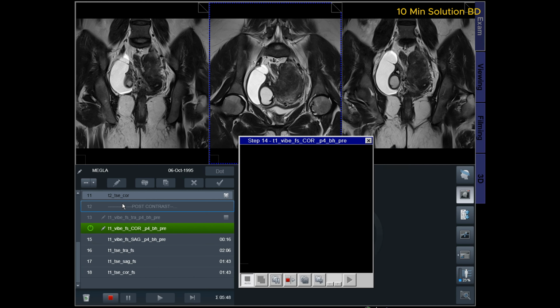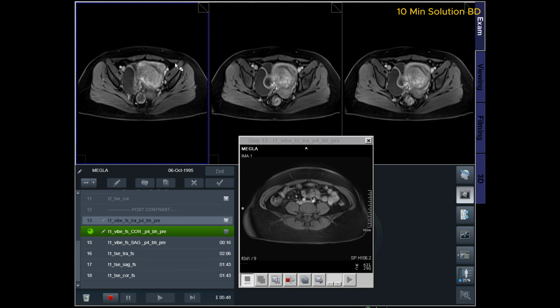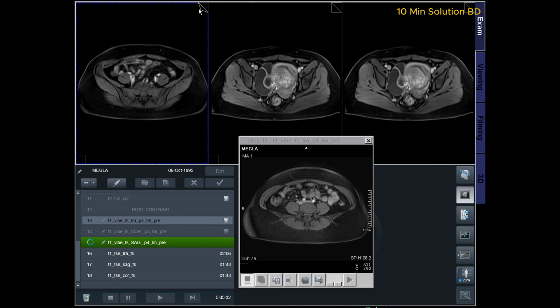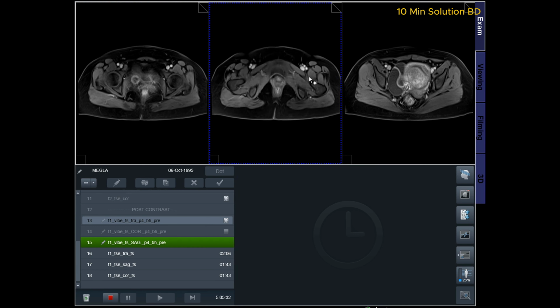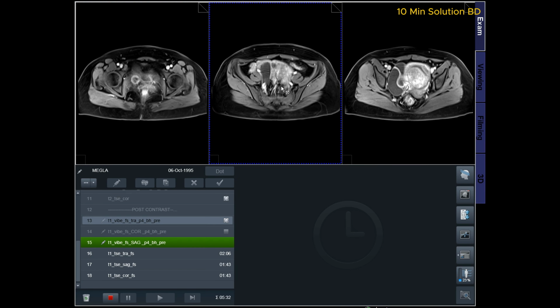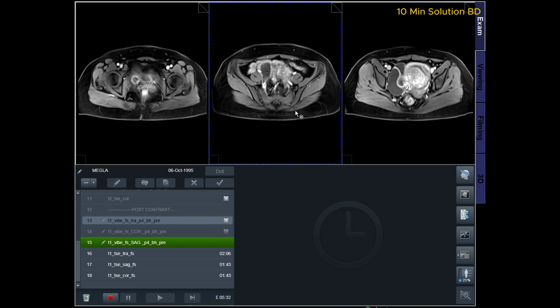Contrast and Buscopan injection risk and benefits must be explained to the patient before the scan. Gadolinium should only be given to the patient if GFR is greater than 30. An intravenous line must be placed with extension tubing extending out of the magnetic bore.